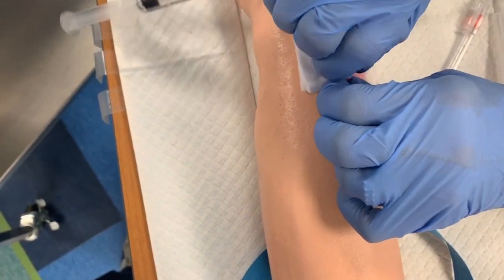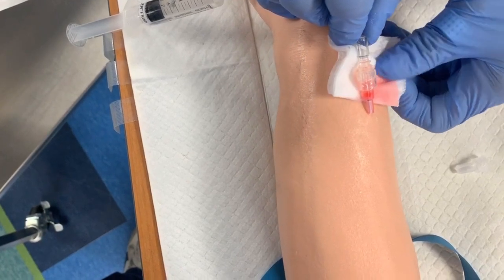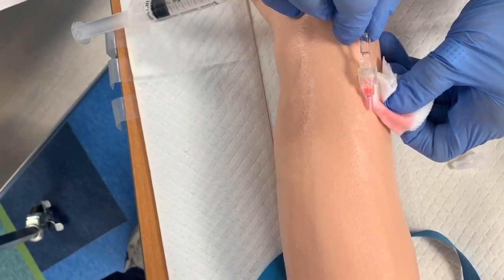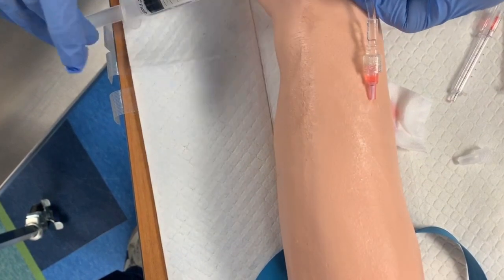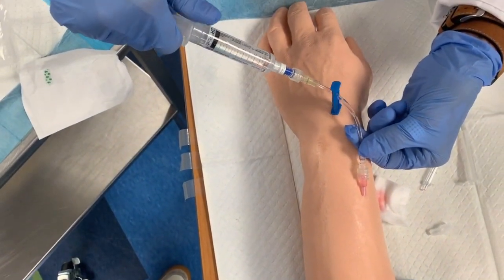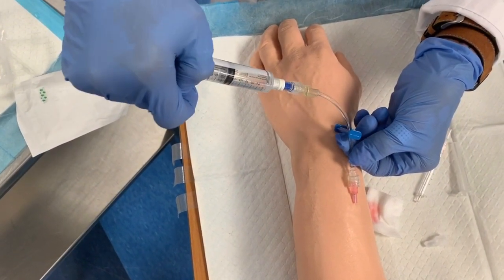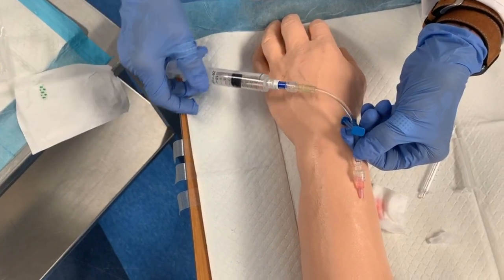And then very carefully tighten your extension tubing. See how we collected our blood drops there? And now when I pull this out, I have no blood on the patient's skin. Now we're going to flush our catheter. So I'm going to pull back a little bit to ensure that I have a good blood return. And then we're going to advance, and see I'm flushing, and it's real easy to flush.